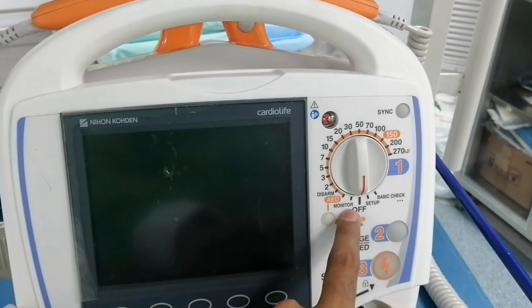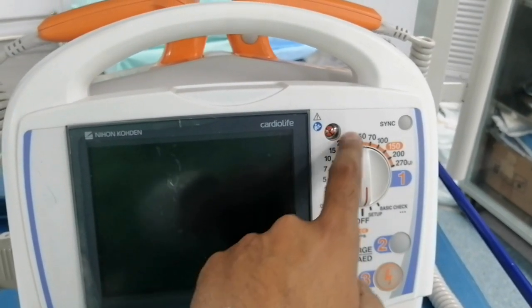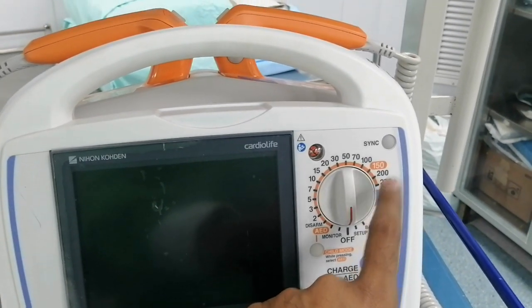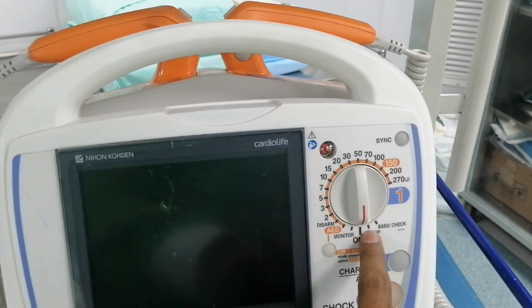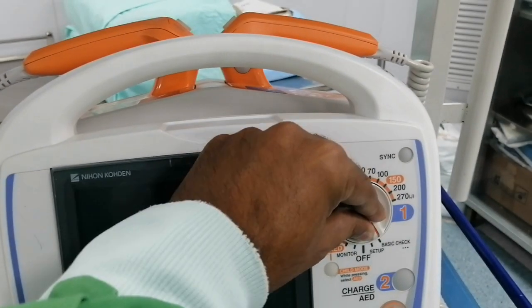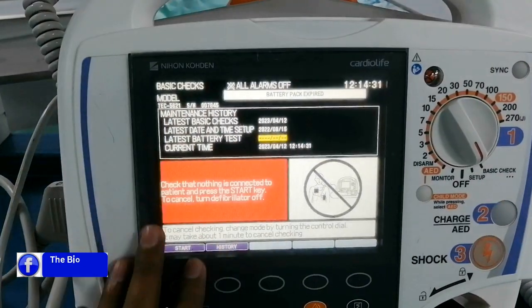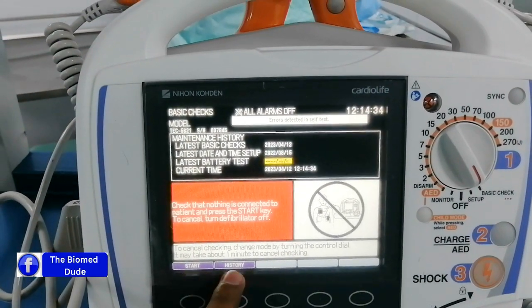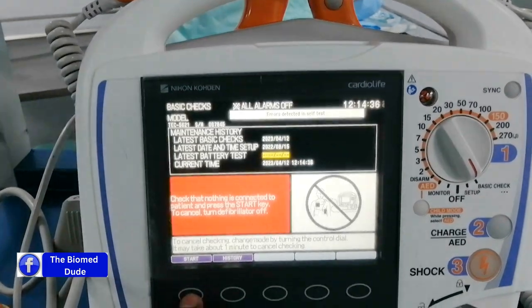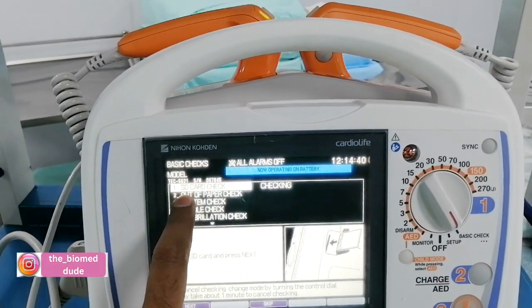Here is the indication for different parameters like basic check, setup of power, monitor, and disarm, and this is the indication of the energy setting. I am just performing the basic check, so I turn on the basic check. This is the initial guideline for the basic checklist. I hit start and there is the history, so I press the start button to initiate the self-test.